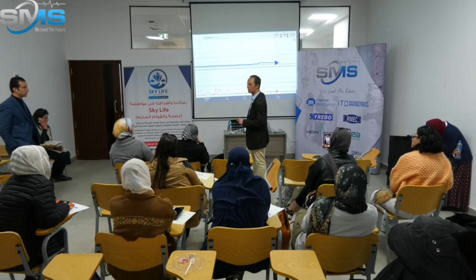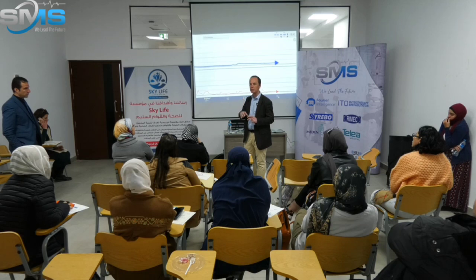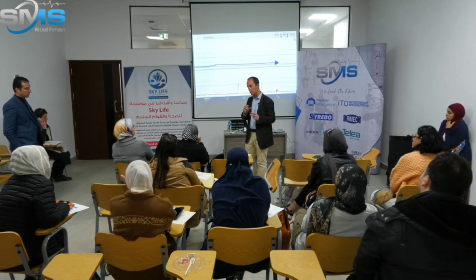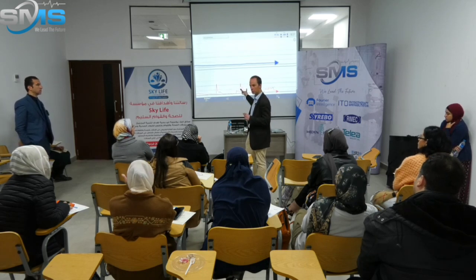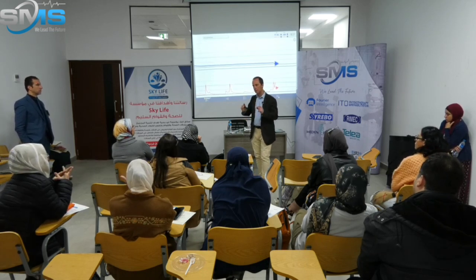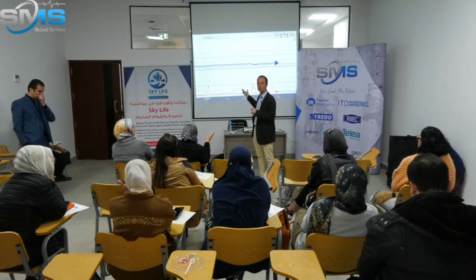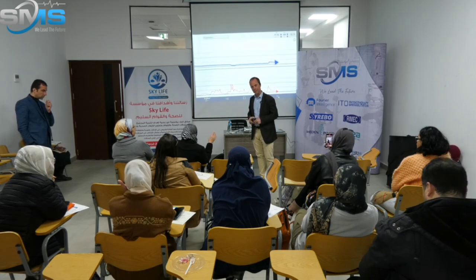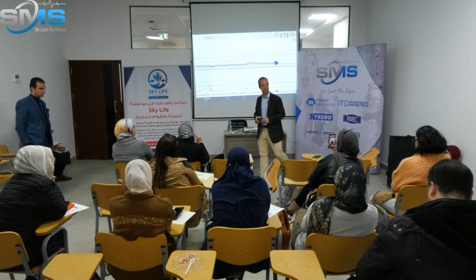In fact, you use this kind of thing when you already did the first part of rehabilitation, having correct muscles. If your muscles are strong enough, now you can work on coordination to make sure they are activated at the good moment. But you cannot start with the weak muscles. If you start with this, it will not work. It becomes okay by physiotherapy. And I can use it in the gym to build more strength. Yes, exactly.